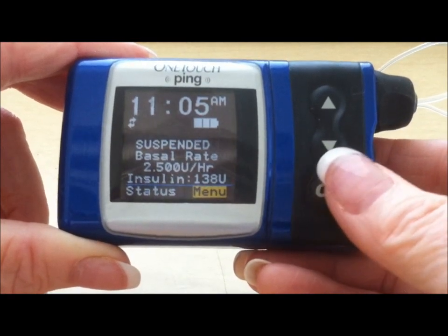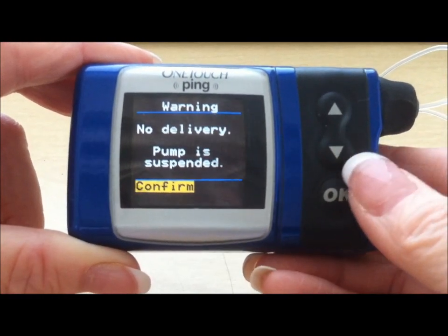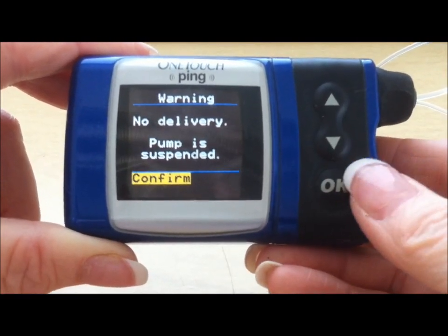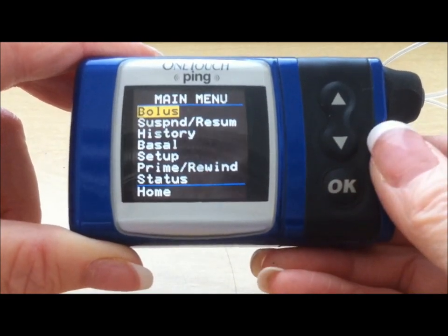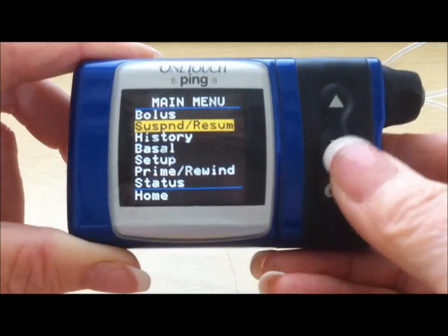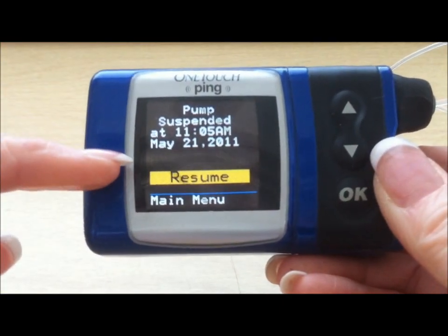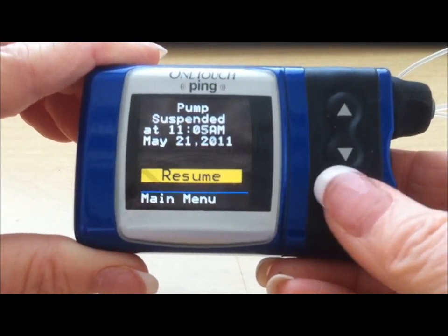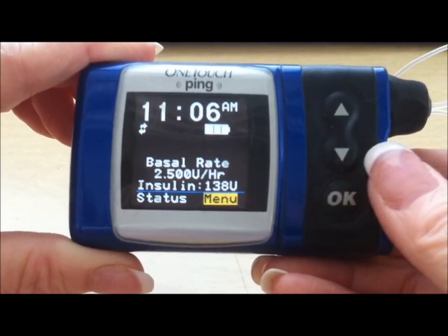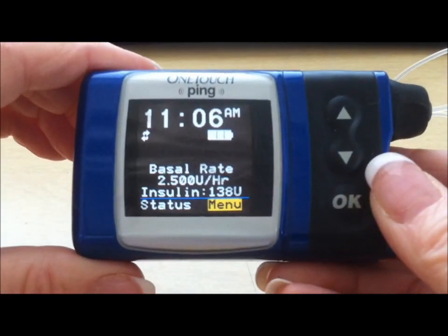To go from a suspend, go to your main menu. It's reminding you that you can't give any insulin because the pump is suspended — press OK. In your main menu, go down one to suspend resume. It will tell you the date and time that the pump was suspended. To restart the pump, hit the resume button, and that reminder that the pump was suspended is gone.